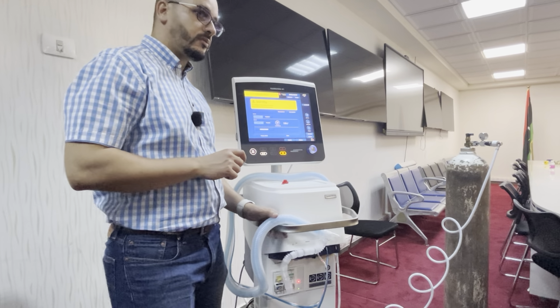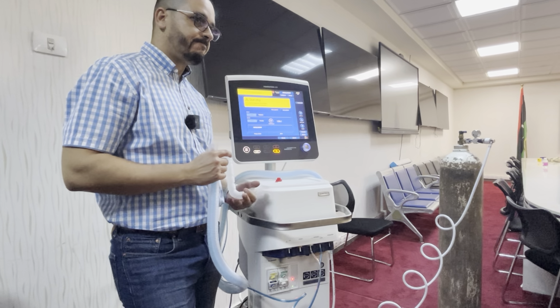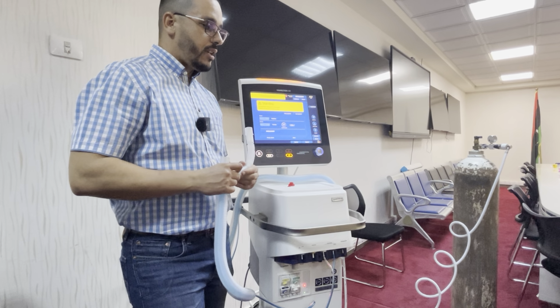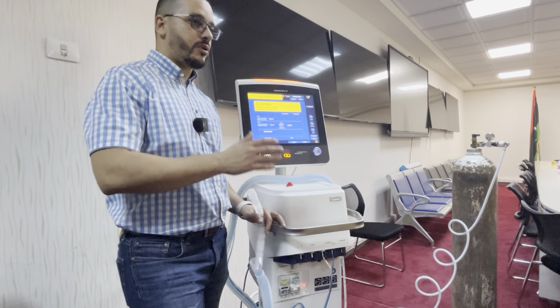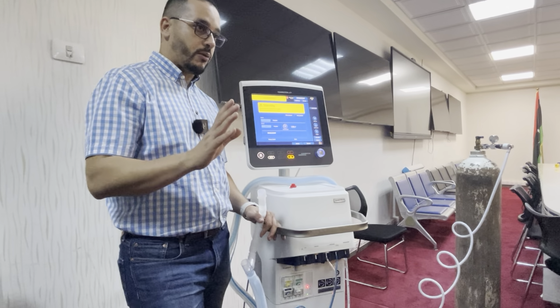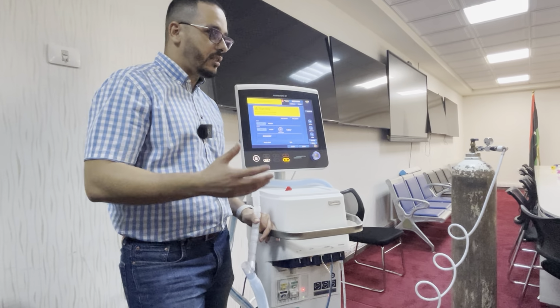There is no chance to use it without a humidifier. Correct. Thirty minutes, or twenty minutes for some quick management of the ventilator. In our case, it's just an economical question, because it's recommended to use the heated humidifier with all types of patients, even if the patient will stay one hour. But the humidifier circuit is not available here, and sometimes it's a little bit expensive.